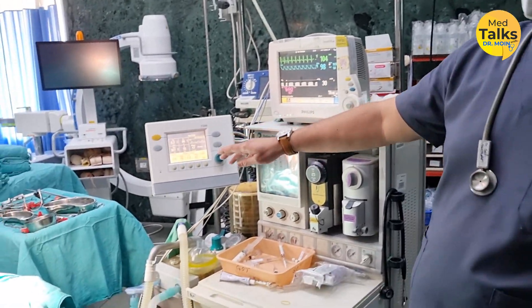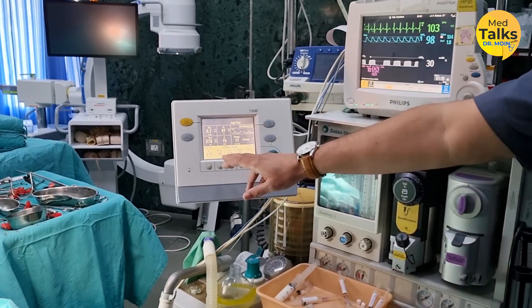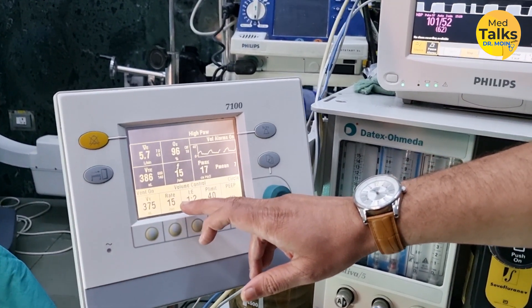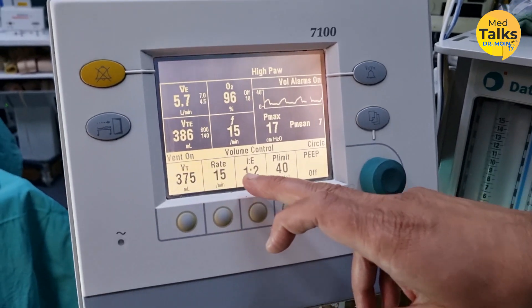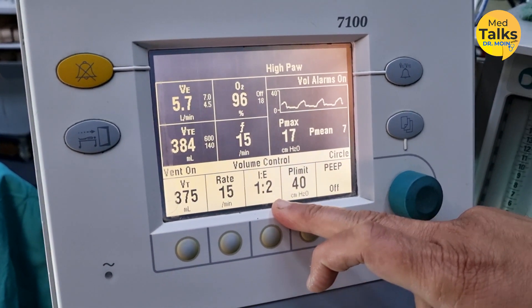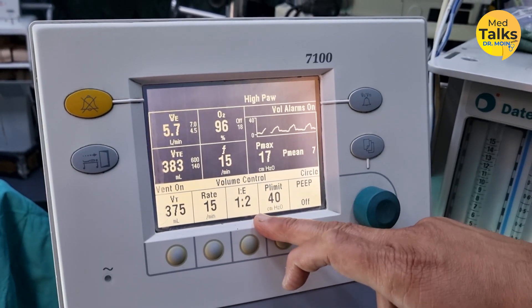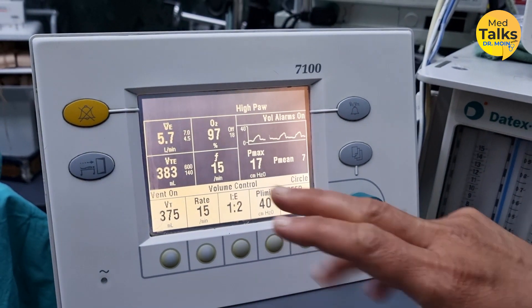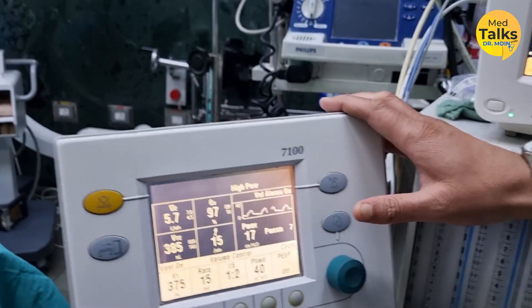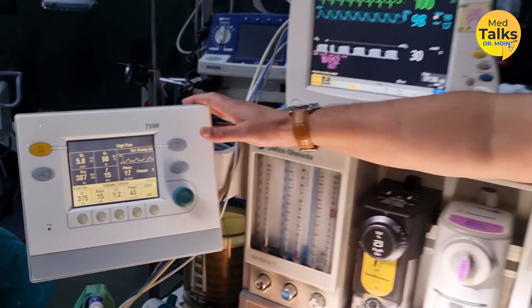Depending upon the weight and age of the patient, we set the tidal volume. According to that, we set the rate — that is the respiratory rate. I:E means the inspiration-to-expiration ratio. We usually keep one is to two: one for inspiration and two for expiration. And that is how we keep the settings on and keep it in the volume control mode, so that the patient is helped in breathing and ventilation.